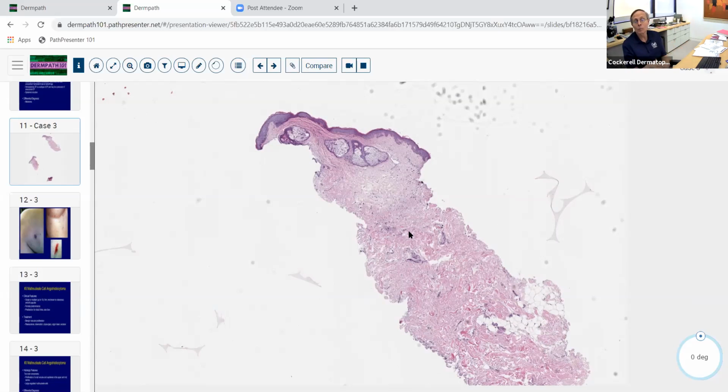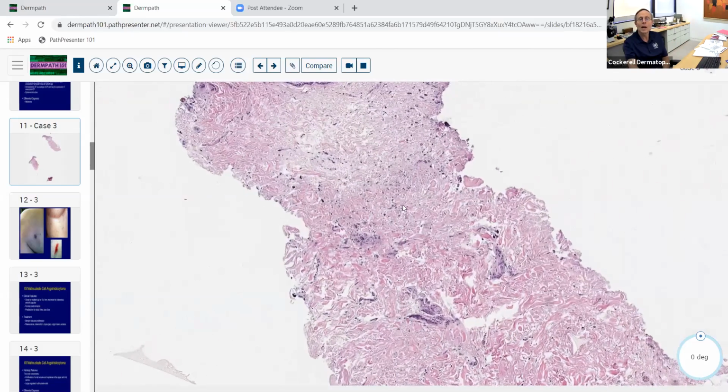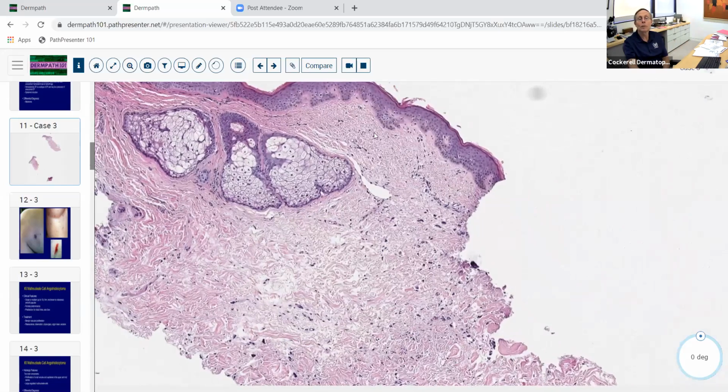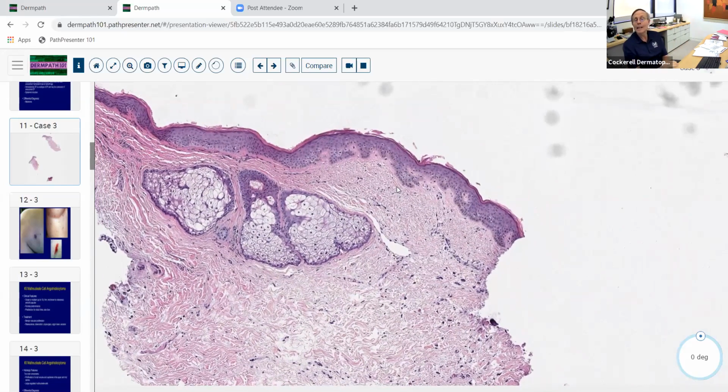What part of the body are we on? Well, some hair-bearing area where there's some sebaceous glands. But that's about all we can really say here. Epidermis looks normal. Maybe it's from an extremity that's got pretty thick collagen. Well, let's go to the dermis and see if we see anything down there, because notice the epidermis is normal. If you're looking at it blind, which we always recommend that you do, don't go to the history first. Always look at it without any information, because then you're biased and you can't put the genie back in the bottle.